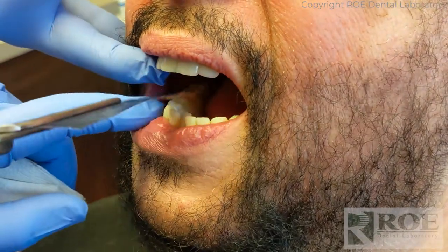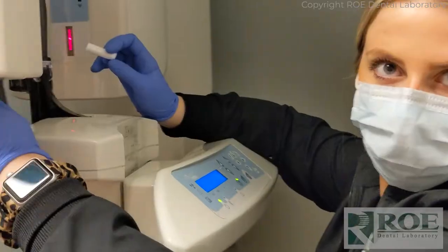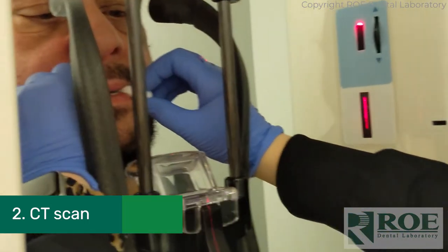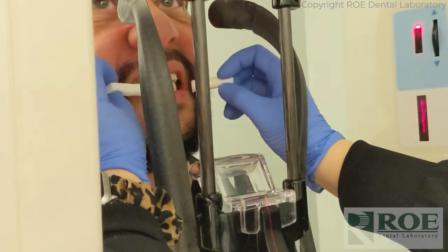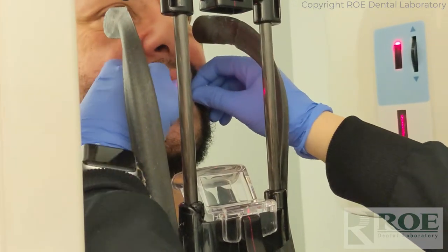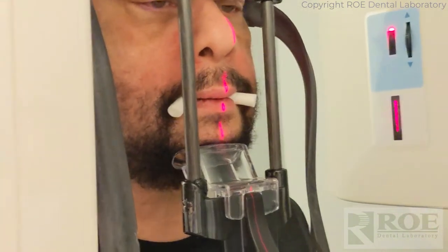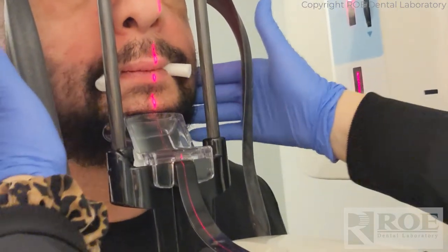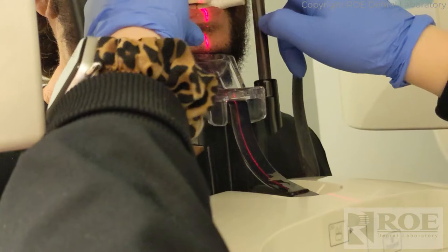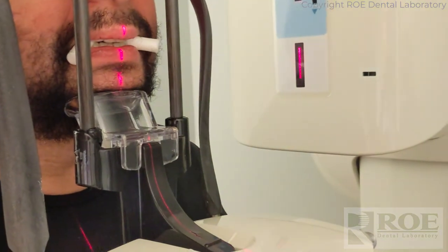Okay, we have bilateral contact. Go ahead and open for me. We're going to place cotton rolls bilaterally. They can even be sticking out sideways — just like that. Chin in the chin rest for me. Are those holding the appliances seated? Yes, on the actual appliance — so they're not tipping, they're holding one up and one down. Good. Does that feel like you're standing up straight? Okay, try your very best not to move.